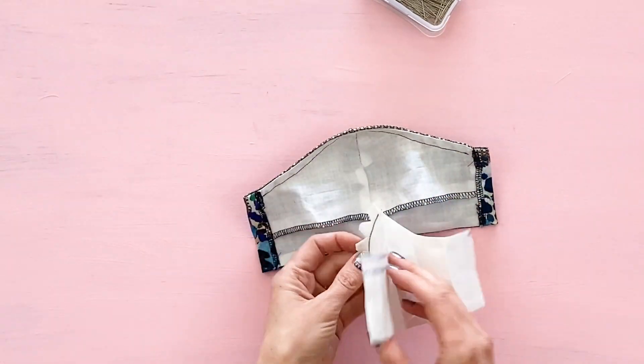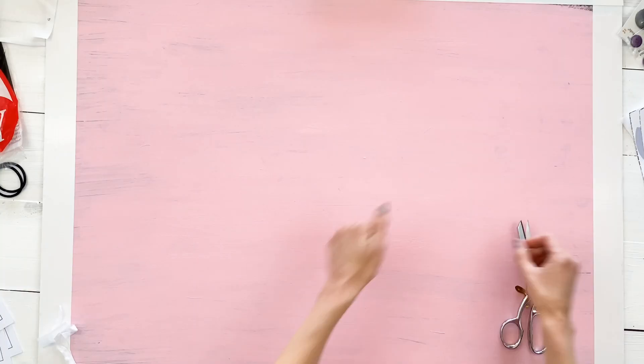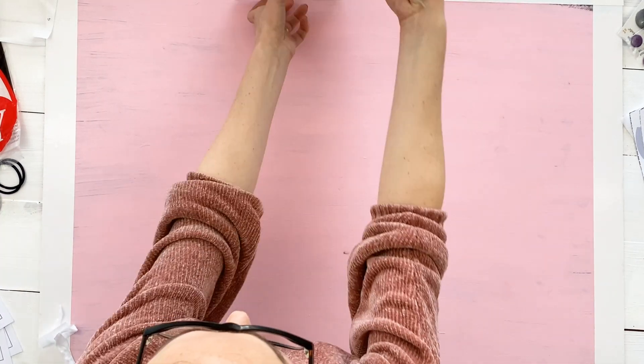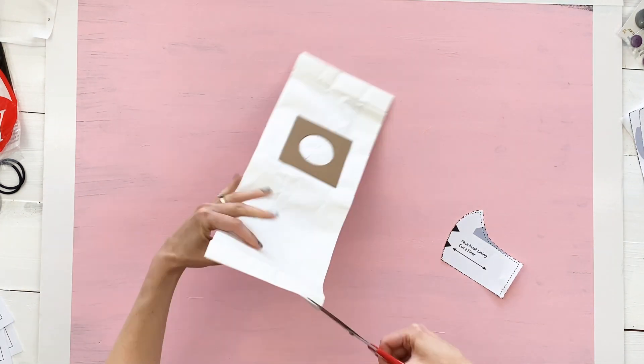Hey crafters, today I'm going to walk you through how to make your own HEPA filter out of a vacuum bag for your homemade face masks. When it's time to cut the filter, first you'll need to open your vacuum bag.